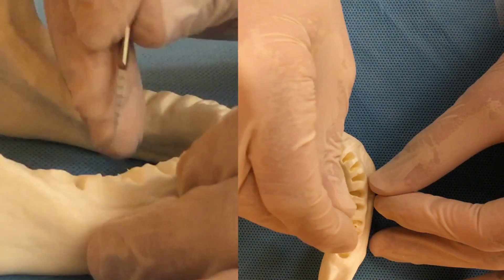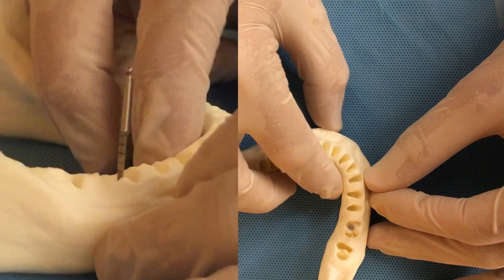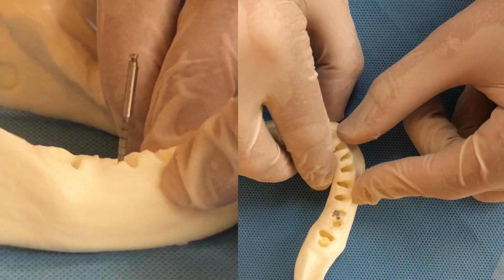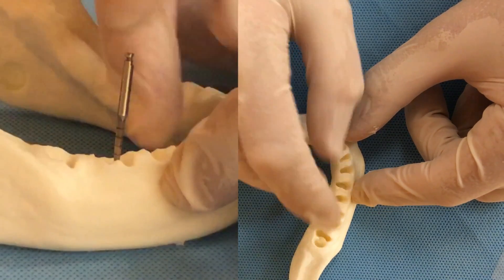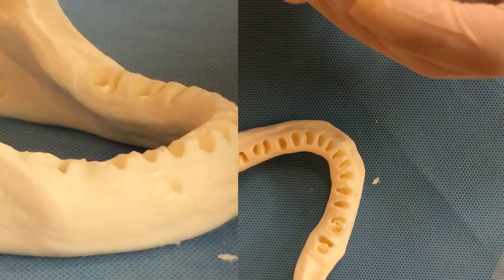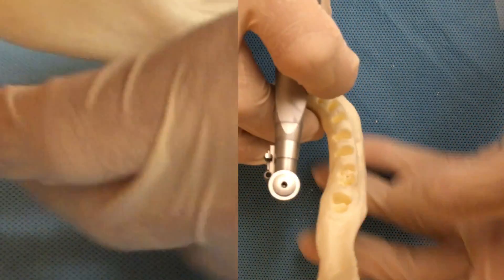Before we keep drilling all the way to the end, we want to make sure our drilling direction is correct. We put the drill in the center of the socket and check if we like the direction — we don't want to be too distal and we don't want to be too buccal. The drilling direction is correct, so we keep drilling. We're going to drill 12 millimeters.